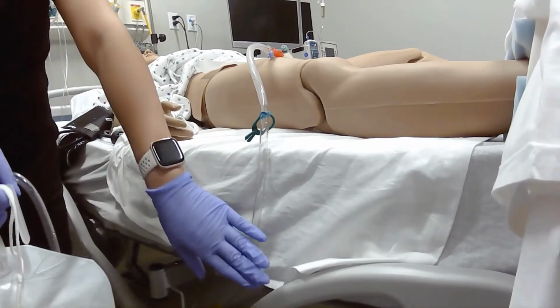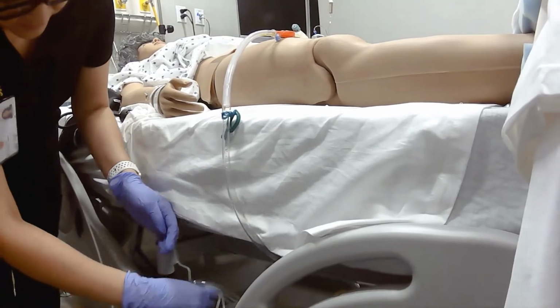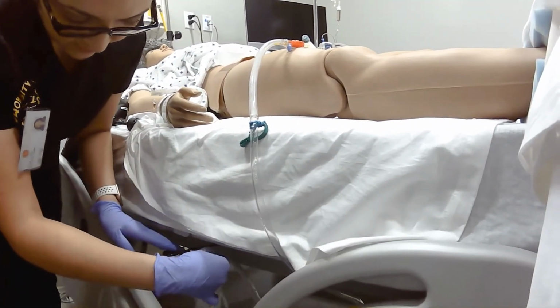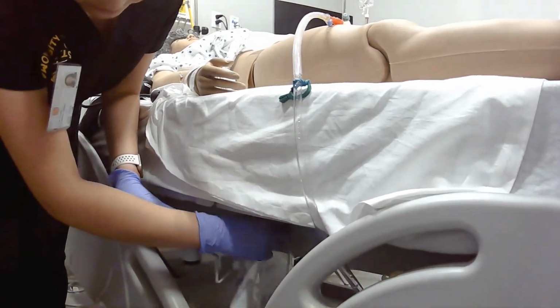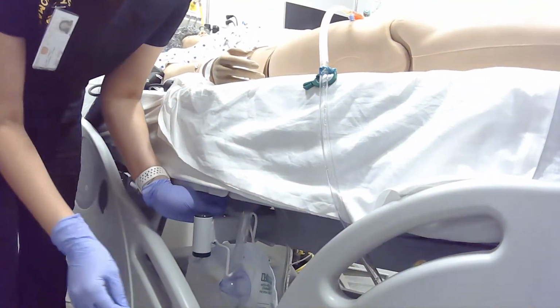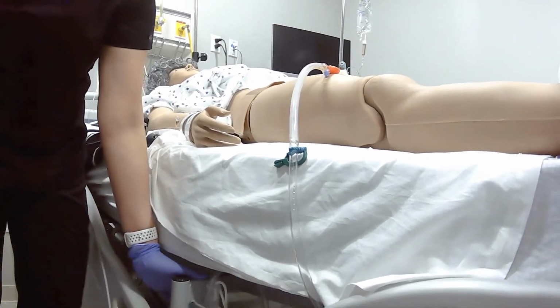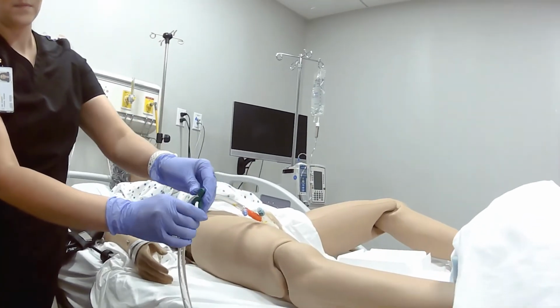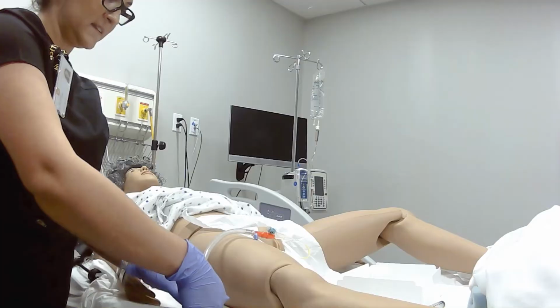So do not use the side rails. We're going to use this hook, okay? Some beds will have a specific hook that's closer to the bed frame, that's easier to use. So this hook over here is the one that we'll use, okay? And then you just hang it like this, and then you would have the alligator clip, which is going to be used for the linens.